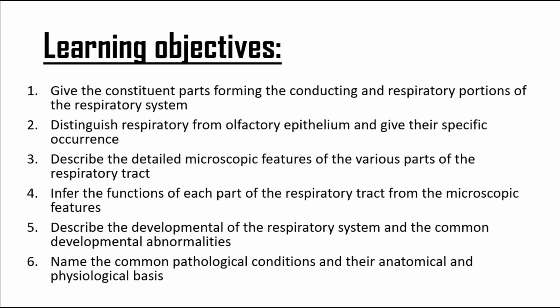Number 2, to distinguish respiratory epithelium from olfactory epithelium and give their specific occurrence, where they occur. Number 3, you describe the detailed microscopic features of the various parts of the respiratory system. This is where it gets very interesting. So we're going to look at all of that.